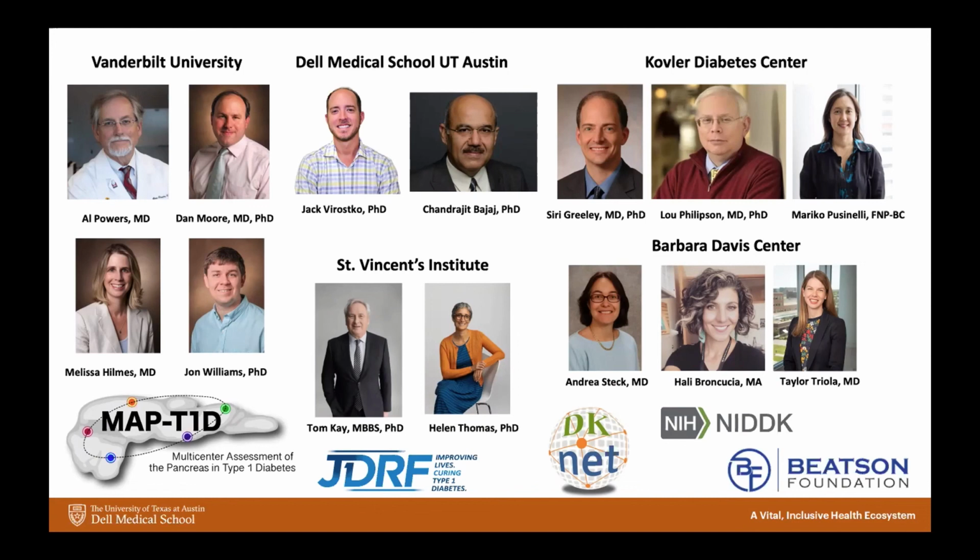It's great because we get the data for free. It's already been taken, it's out there, but I would love to go back to the MRI tech and say, could you just add like 5 more slices to the bottom of this scan so that we can get the whole pancreas, and we can't for the pancreas. And my thought would be for a lot of the abdominal organs, we're also going to get cut off just because they're always centered on the liver, and they don't tend to take a lot of images on either side. We're just fortunate that typically the pancreas is in that same plane as the transplanted liver. A great idea, though. I love that idea.